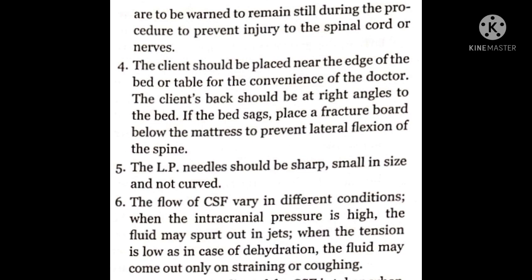4. The client should be placed near the edge of the bed or table for the convenience of the doctor. The client's back should be at right angles to the bed. If the bed sags, place a fracture board below the mattress. Prevent lateral flexion of the spine. 5. The LP needles should be sharp, small in size and not curved.